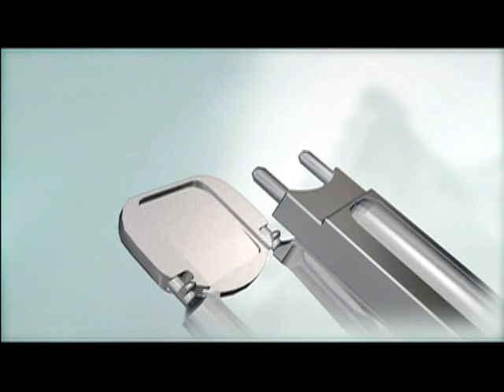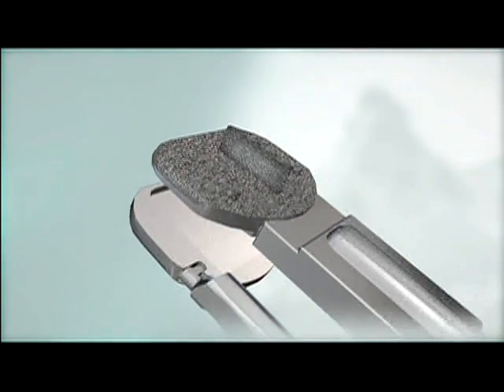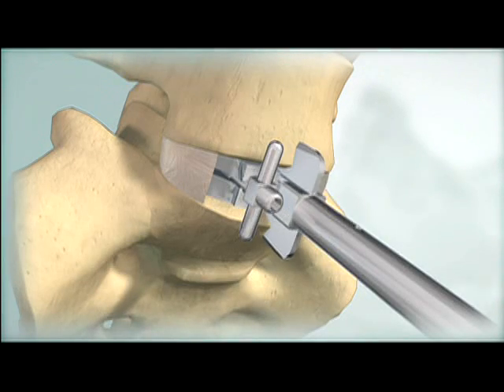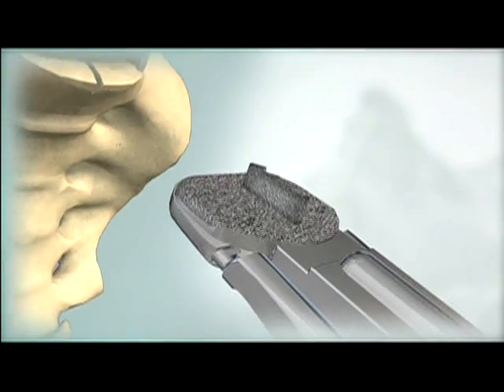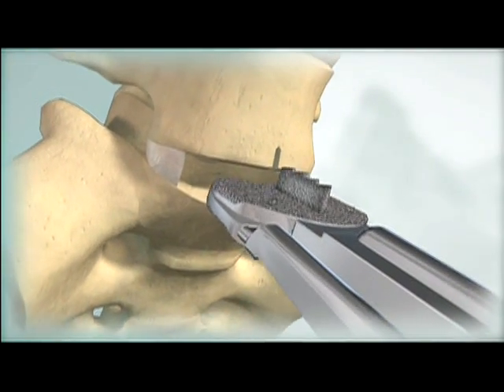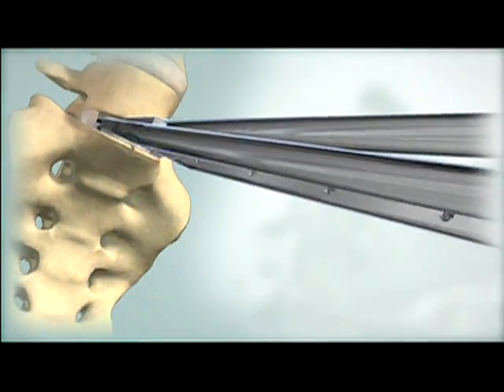Load the inferior end plate and superior end plate onto the inserter and nest the two end plates together. Remove the chisel and trial. Align the keels of the ProDisc-L Implant with the chisel cuts and insert the end plates to the posterior margin of the vertebral bodies.